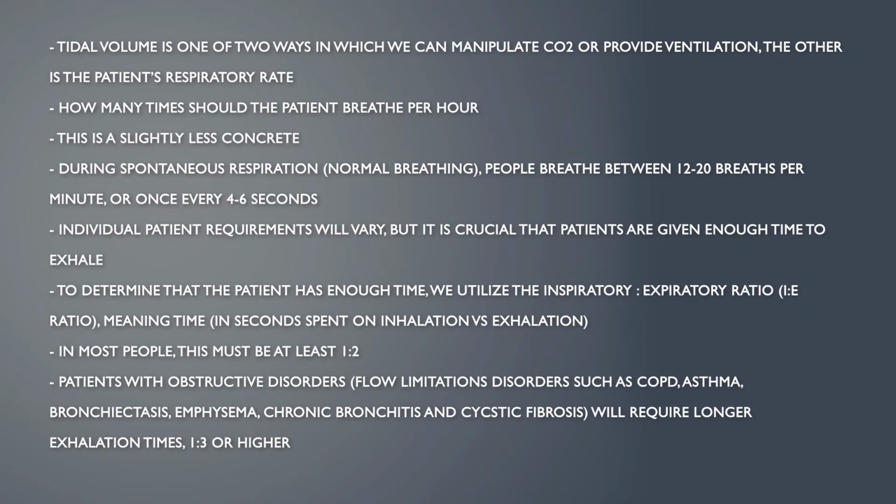Now, in patients who have underlying respiratory conditions, especially obstructive conditions, we might see CO2 retention because that patient doesn't have the elasticity required to exhale as quickly as we'd like them to. Now, that's something that you're going to see in patients, and it's something that we need to adjust for. We need to give patients time to exhale.